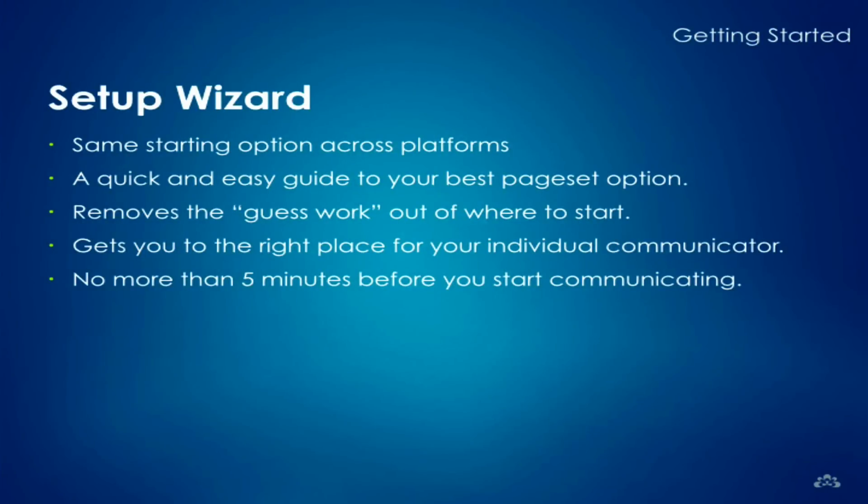Now, the first thing that I want to show you is when you receive your DynaVox T10, which is a tablet based on the Android operating system, or if you are using the Compass app on an iPad or even a Windows tablet, you can start getting started and find the right page set by using the setup wizard, because some of you might not be sure of what page set to use with the individual you're working with.